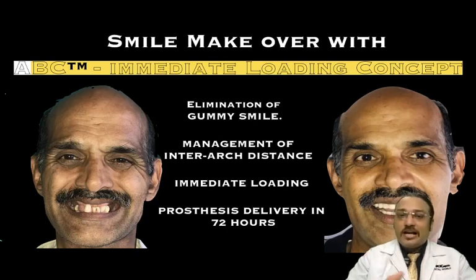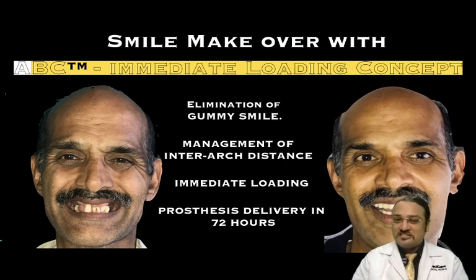That's how we achieved 3 most important goals: the elimination of the gum smile, and management of the interarch distance. We did immediate loading and gave a prosthesis, teeth, or a new smile to the patient in just 72 hours.